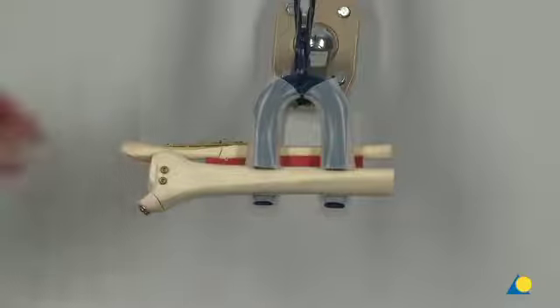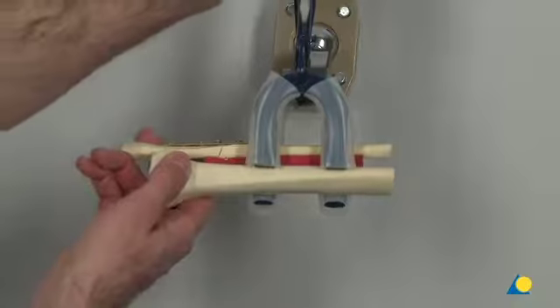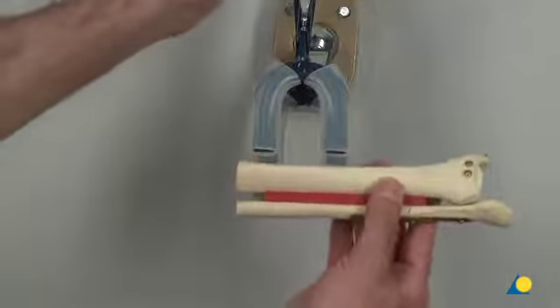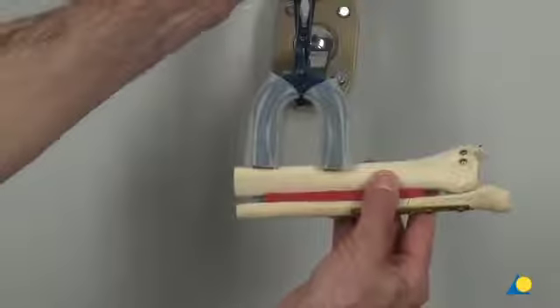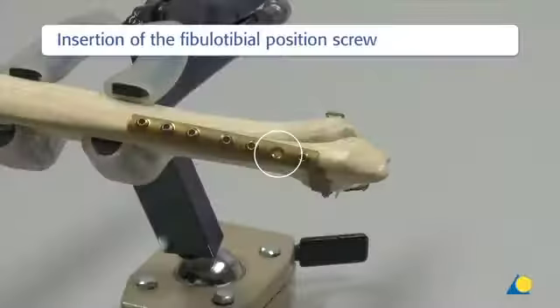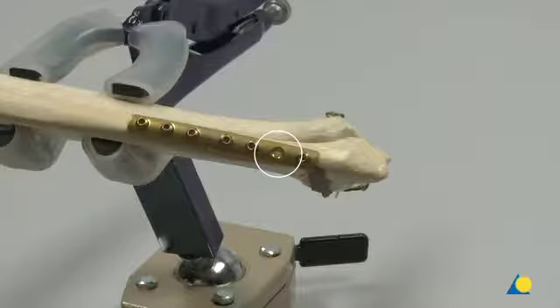To facilitate the insertion of the position screw, the bone model is released from the clamp and rotated 180 degrees. To facilitate the insertion of the position screw, the bone model has been returned to its original position. In the clinical situation, the ankle is dorsiflexed for the insertion of the positioning screw. This ensures that the upper ankle joint is at its widest position.